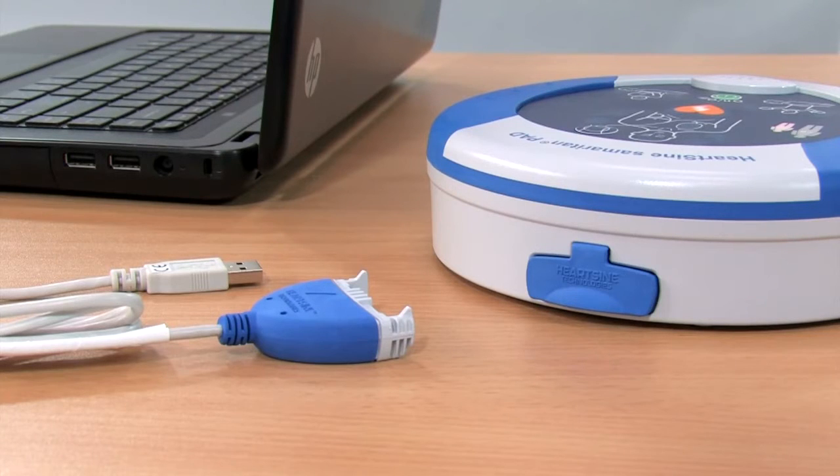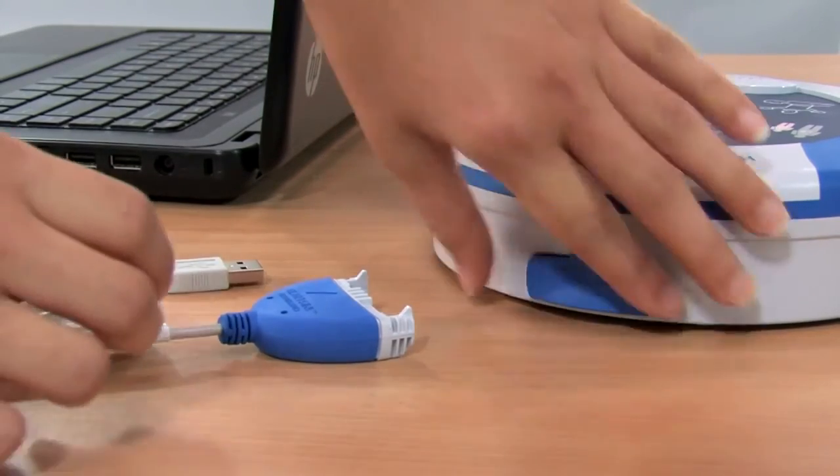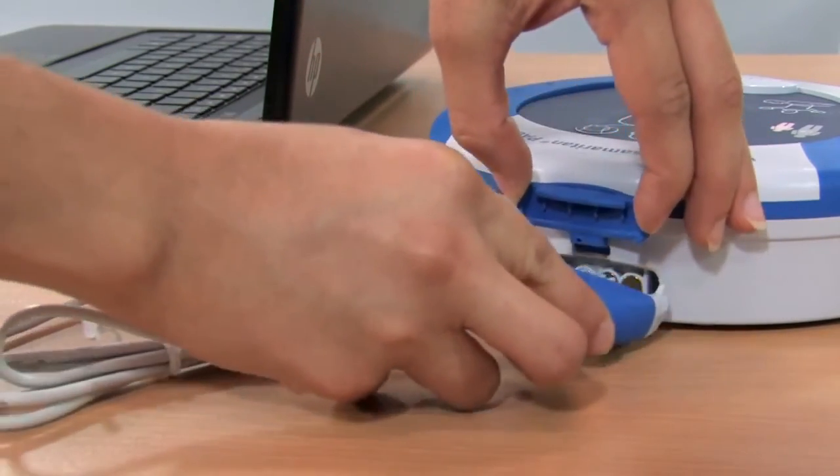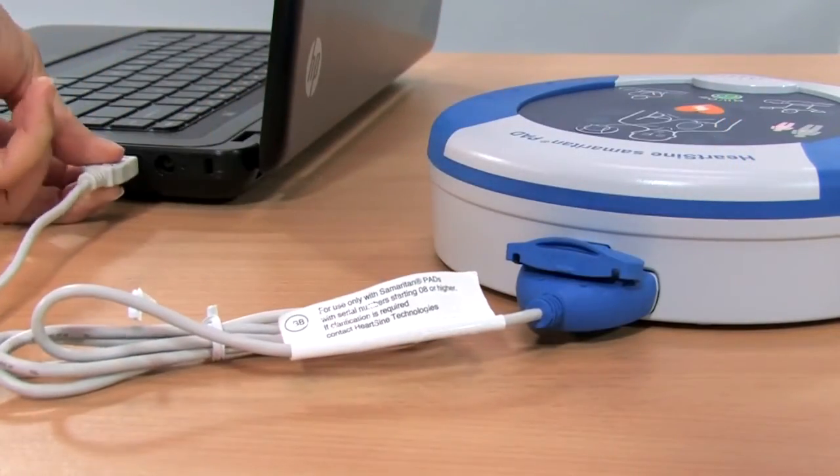The Samaritan PAD logs up to 90 minutes of heart rate information after use. A physician may want the event data from the PAD to make treatment decisions. To download the event data, use the data cable. After downloading the information, please erase the data from memory.